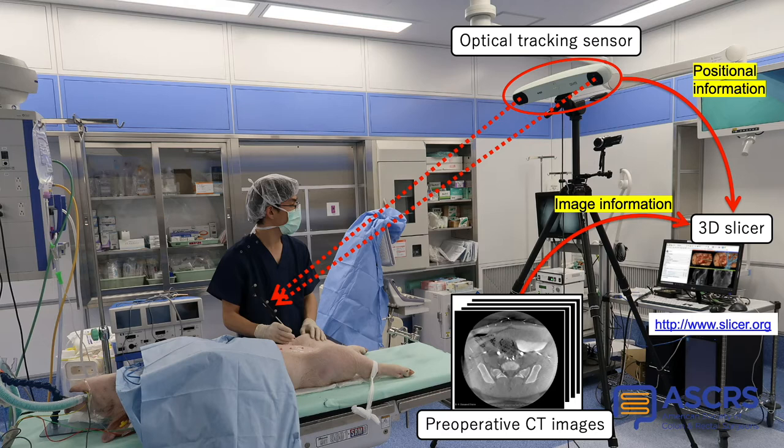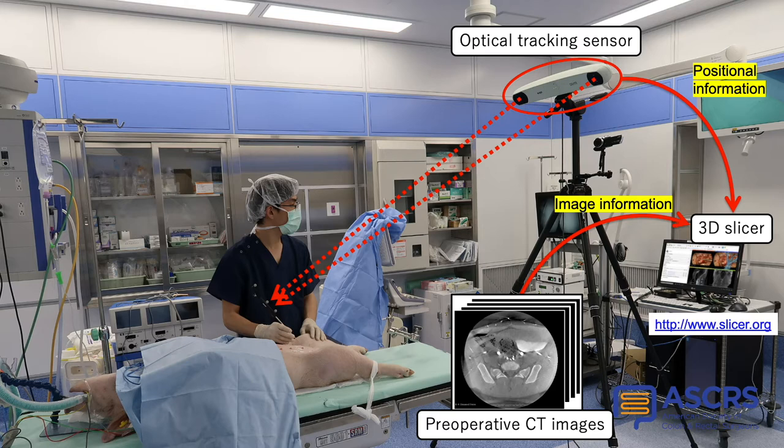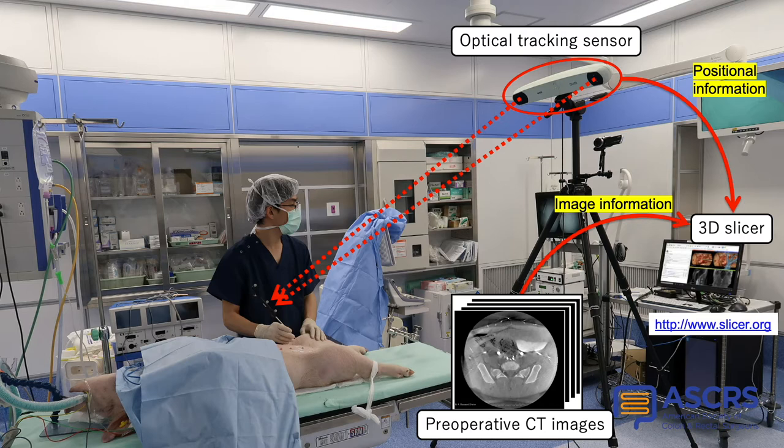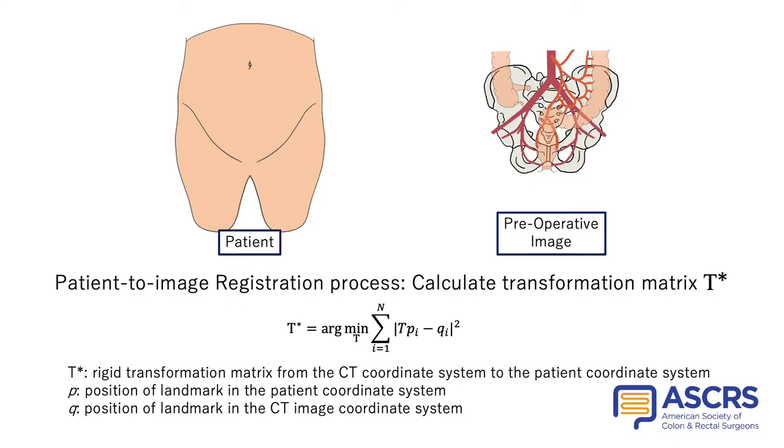The viewpoint of the laparoscope and 3D reconstructed CT images can be synchronized using the positional information from the tracked scope, which makes it possible to achieve augmented reality-based navigation in which useful anatomical images are superimposed onto the laparoscopic view.